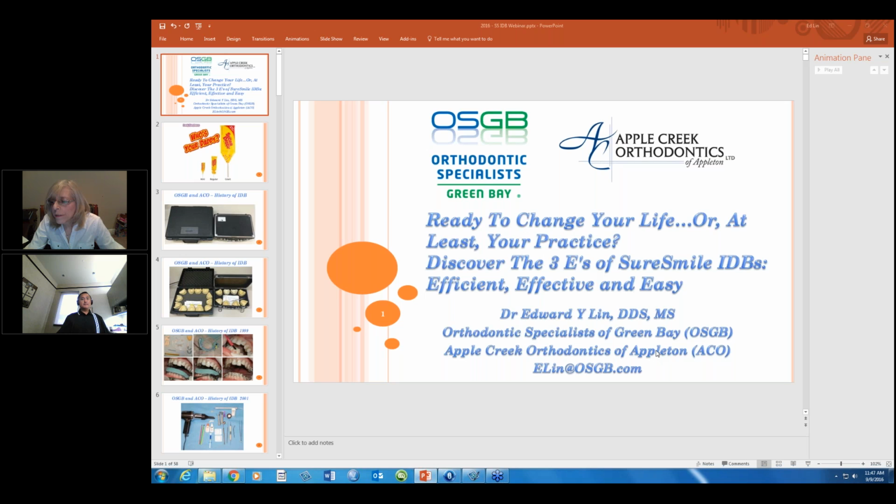Is arch form width something we control in setting up our program? In other words, can we set up the specific arch forms? You can in SureSmile if you do brackets and wires. But because this is just an indirect bonding system, I do not believe that you can do this in SureSmile's indirect bonding system because you're not ordering any wires off the system.